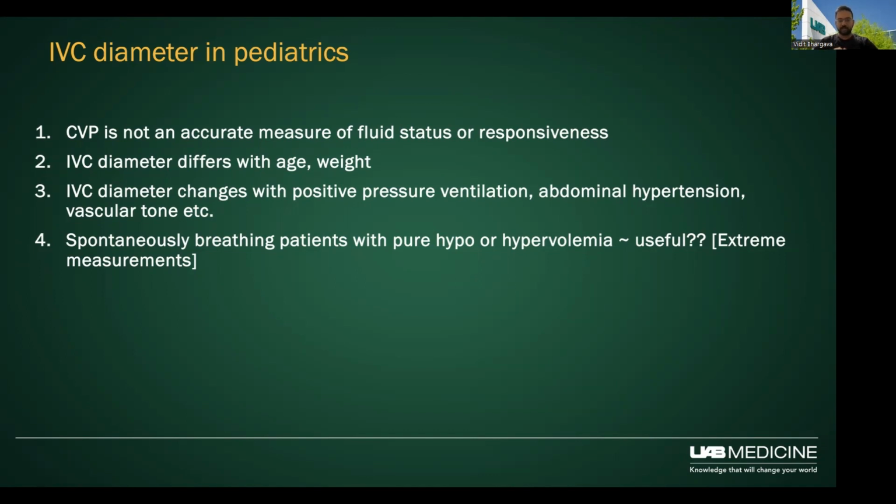And actually, Dr. Basu's study that was published, I think, 2 or 3 years back, showed that IVC values could be a useful predictor for patients' fluid overload status rather than fluid responsiveness.